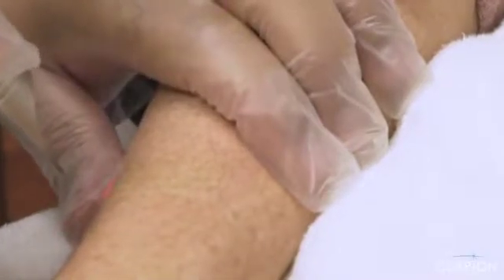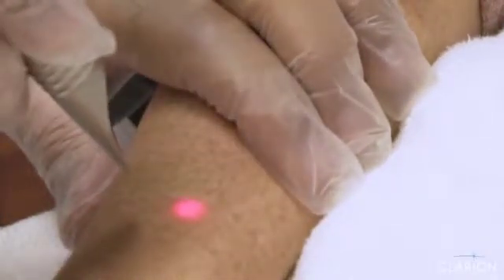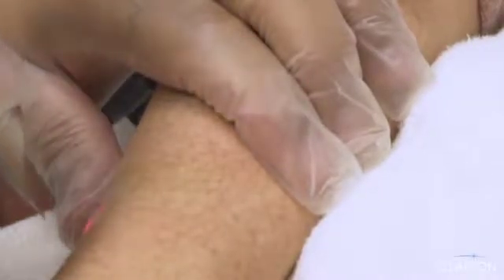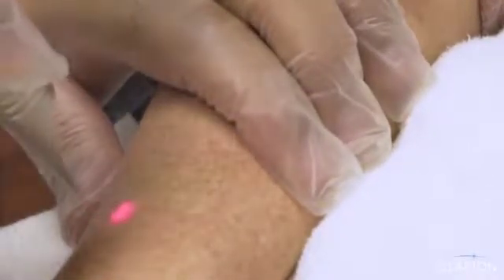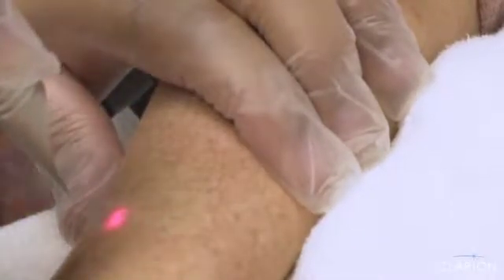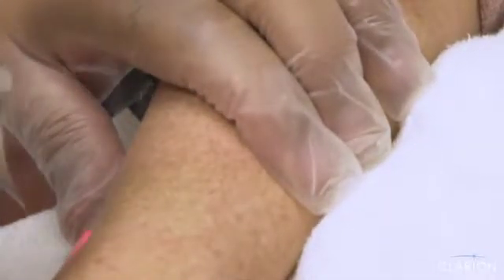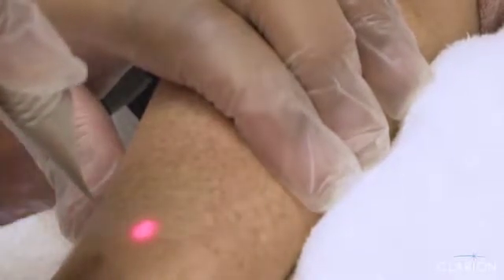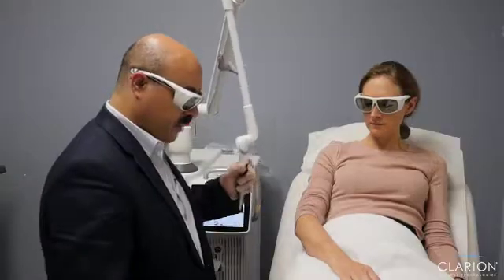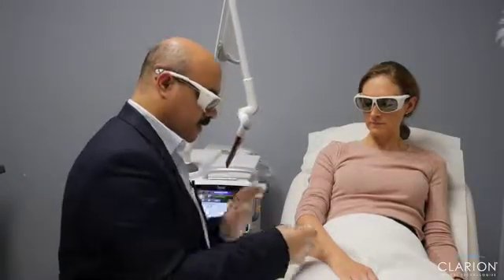How is the pain? Tolerable. It is tolerable. Okay. And keep in mind that this is being administered without anesthesia. If we apply topical anesthesia, then the patient will feel nothing. So this is one pass on this area where we would like to clean the skin.